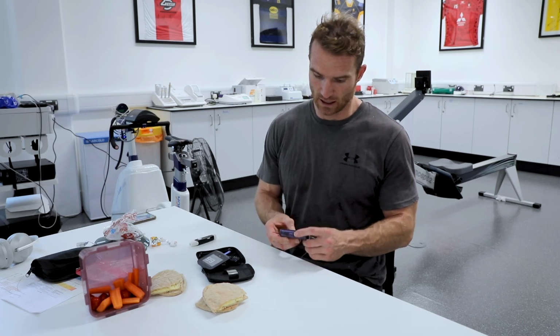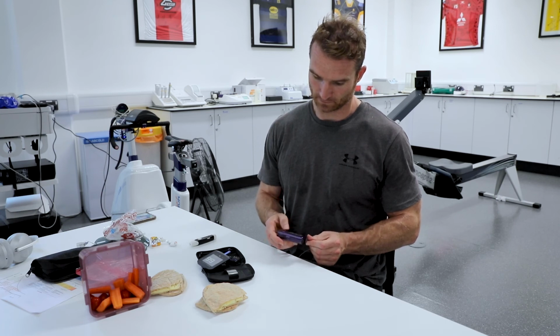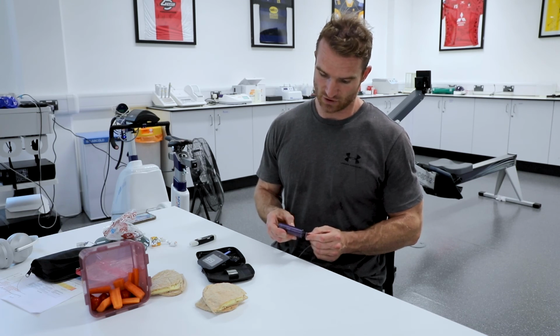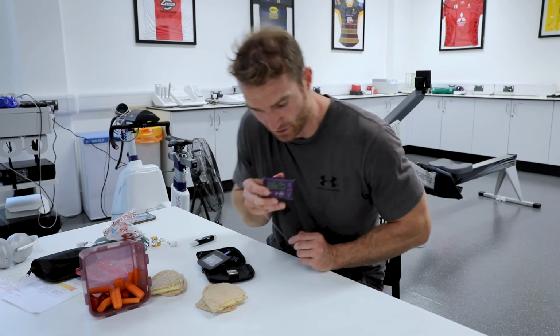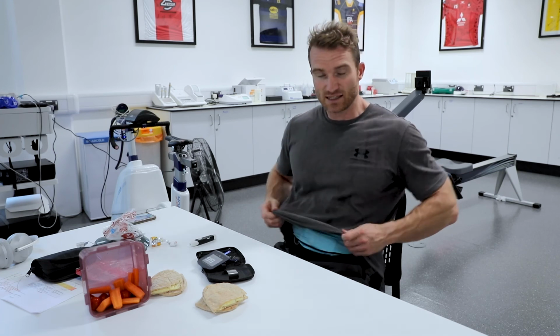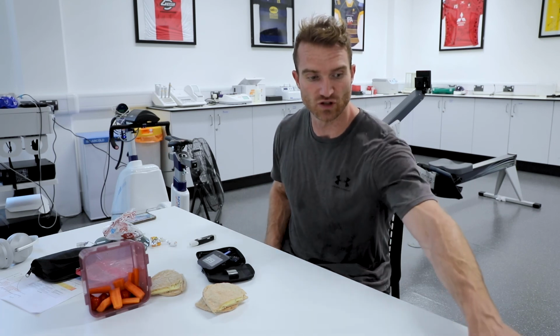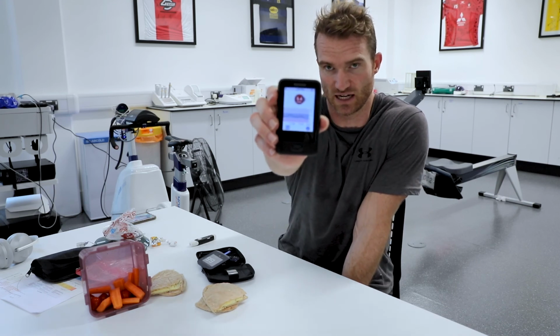So if I dial in my 60 grams of carbohydrate, it's going to suggest 3 units. So I'm just going to give 1.5 units. That's been delivered. So what should happen is my sensitivity to insulin is almost doubled, hence why I only need to give half the insulin. And what we'll be able to check is what happens to this glucose trace over the next 3 to 4 hours.